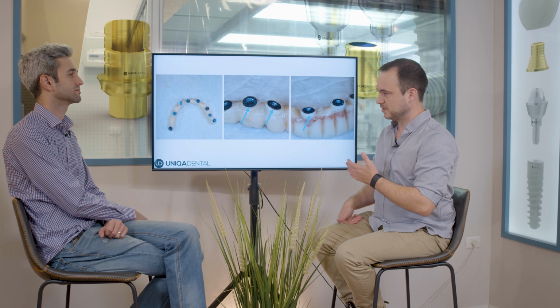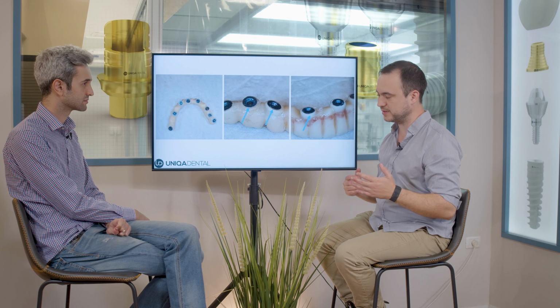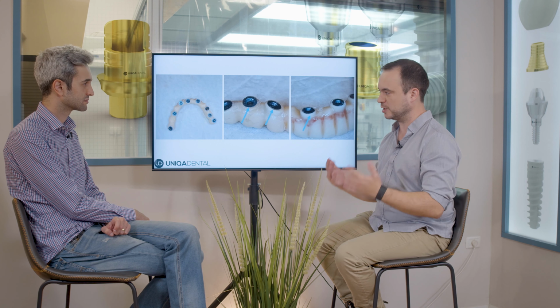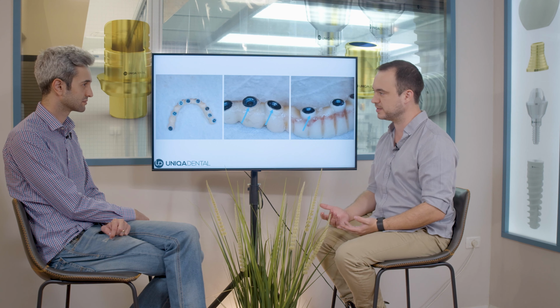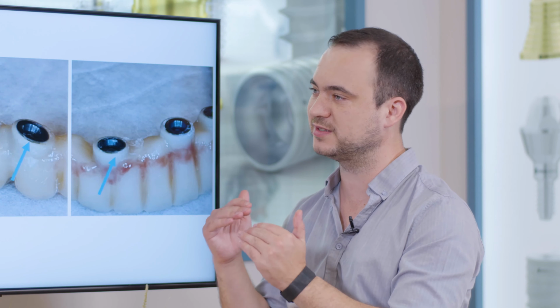Then we milled the zirconia. The sintering process also introduced some deviations. All of these deviations go one on top of another, and then in the final process you get some inaccuracy. If you didn't do it in the same way, you wouldn't see these inaccuracies. You just had internal forces in the zirconia bridge, and then after one, two, three days, maybe a couple of weeks, the zirconia will just crack. And you'll see two parts of the zirconia, one higher than the other, for example. It will just pop.